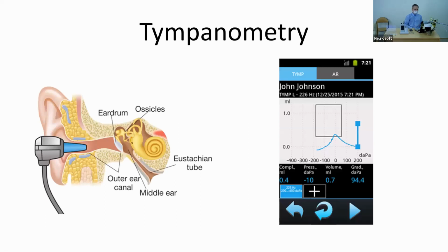So actually, there is a group of tests for a middle ear analyzer device like AudioSmart, and they're called acoustic immittance, and we will start with tympanometry and then proceed with the other ones. So what is tympanometry? Tympanometry is a test where also a probe is used inside the ear canal, but in this case the probe, in addition to delivering the sound, which for this test is called a probe tone, a low frequency tone.